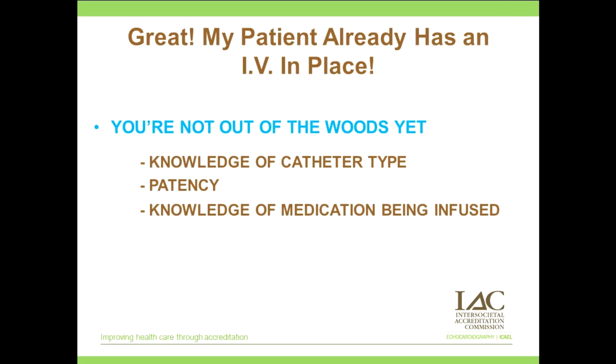You'll also need to know what kind of medication is being infused. If there are lines of medication bags going in, you'll want to know what's being infused, where should I go with the contrast. In this situation, I just tell you, consult the patient's nurse and ask for assistance.